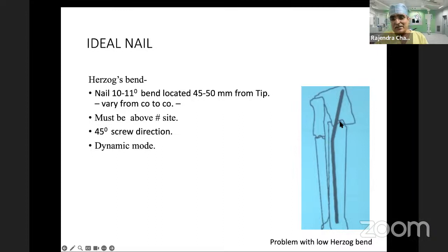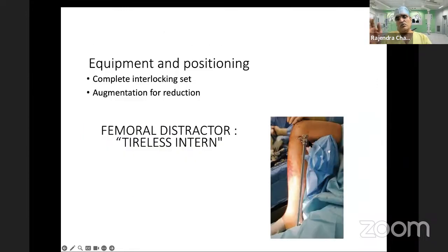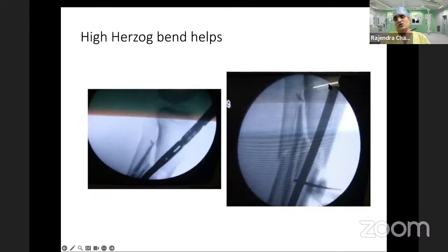And the recommendation is, I will go along with one or few recommendations as well, that the Herzog's bend should be higher. That is what most of the nails are doing nowadays. But this is a common scenario. How to avoid it? One is getting a higher Herzog bend. And when you take the C-arm shoot in a lateral view, when we are passing the nail at this junction, it goes a bit difficultly. So try to bend the nail posteriorly. The proximal end, try to get it more posterior towards the hip of the patient, so that the tip of the nail is not jutting the posterior cortex, it should jut the anterior cortex.